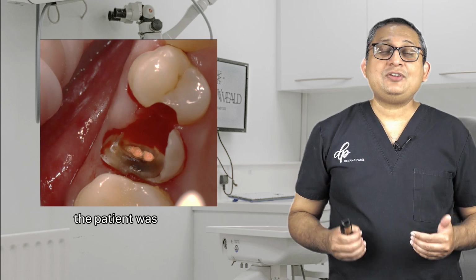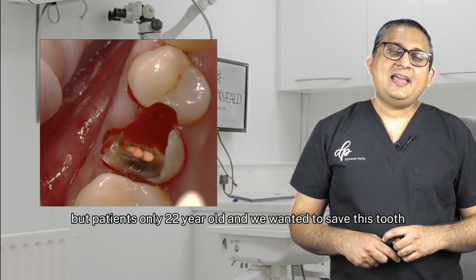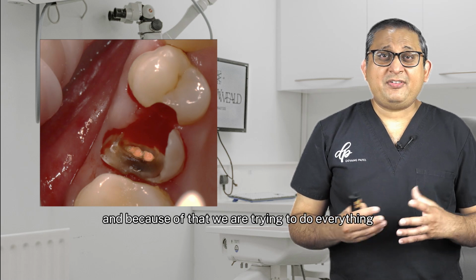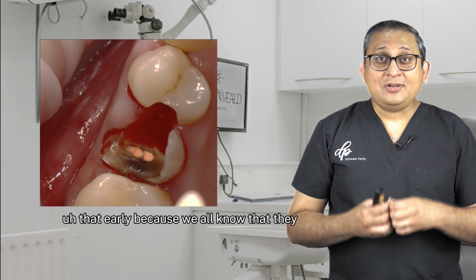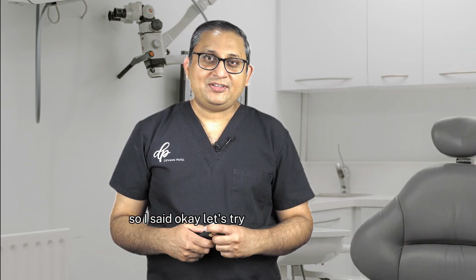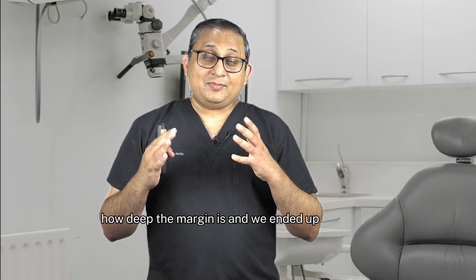The patient was referred to me initially for implant placement, but the patient's only 22 years old and we wanted to save this tooth. Because of that, we are trying to do everything to keep it, because I don't want to place an implant in a 22-year-old that early, because we all know that they don't last for a lifetime. Nothing lasts for a lifetime. So I said, okay, let's try and save the tooth. But as I said, in here you can see how deep the margin is, and we ended up doing this.